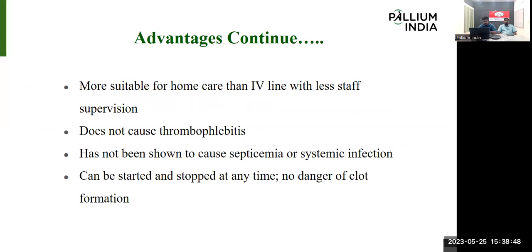As I already told, this subcutaneous injection or infusion is not only for staff. After the patient is discharged from the hospital, if an injection form of medication or infusion needs to continue in their home setting, we can educate the caregiver about the subcutaneous injection and infusion. Or if a home care team needs to visit the patient and family, maybe the team will have only one nurse, and nobody will accompany them.